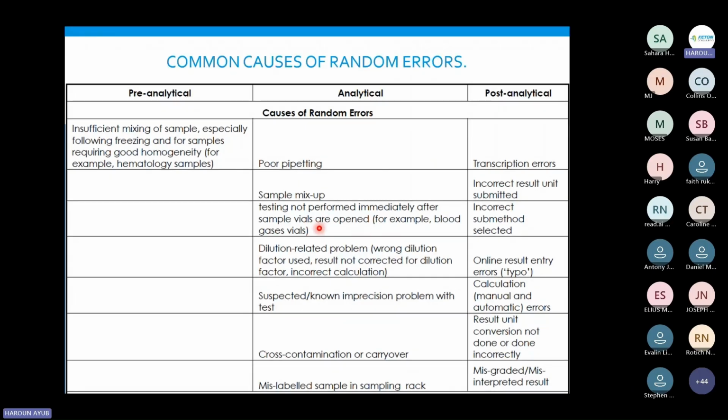Usually it happens where you've reconstituted for 30 minutes and then you leave it in the dark at room temperature for 2 hours, because that day the patients and everything is not working. The patients are coming in plenty, you are alone in the lab, pressure is high, and you forgot your sample. At that point you'll call us saying our EQA is failing and so on. But in the background of it, you need to understand that how you handle that particular sample will affect the results.